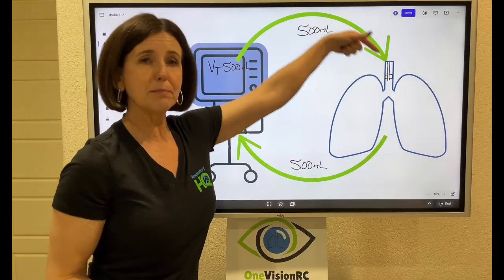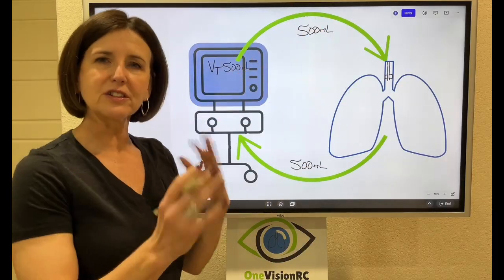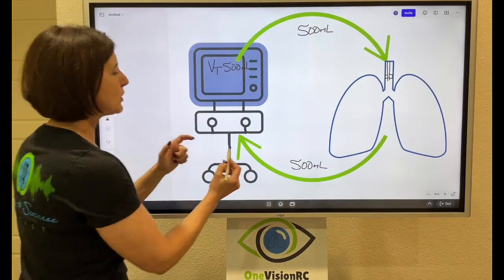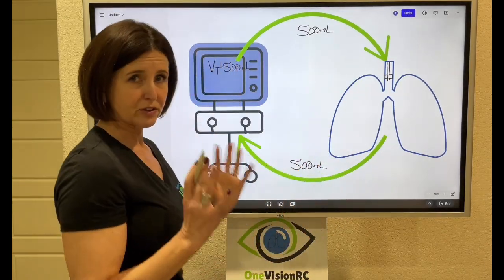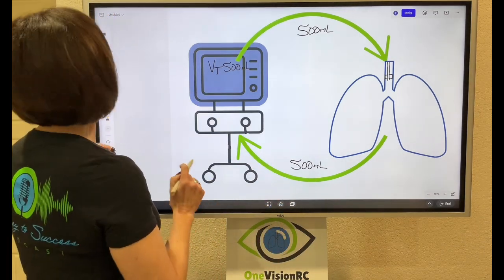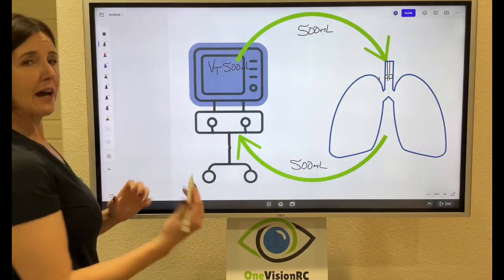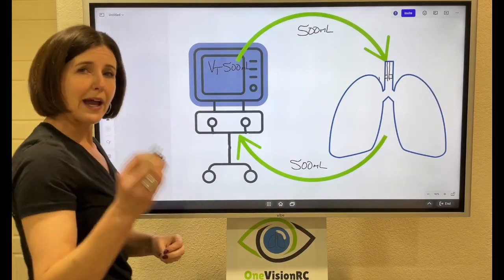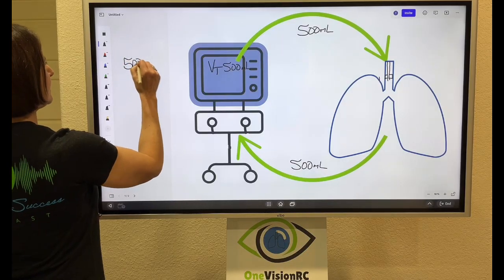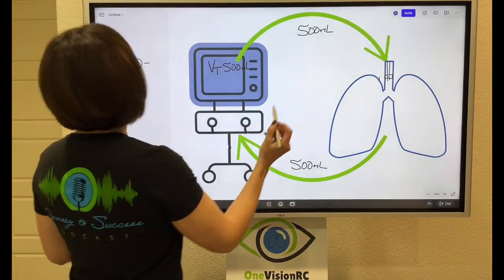So we're looking at inspiratory tidal volume versus expiratory tidal volume. It's not always going to be exactly spot on — 500 in, 500 out — there's a little bit of variation. What we're going to be looking for is the exhaled tidal volume, and there's a little bit of math involved. When we have the cuff inflated and you push 500 in, 500 comes out. This is the first part of the formula: you have to have the cuff inflated tidal volume — what's coming back to the vent is 500. That's your cuff inflated exhaled tidal volume.